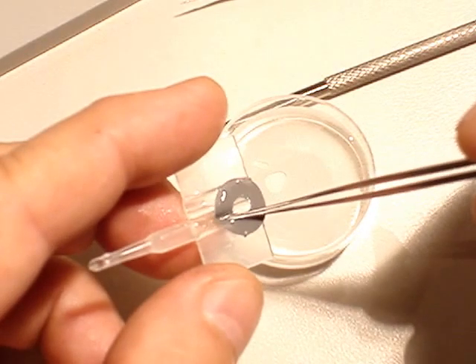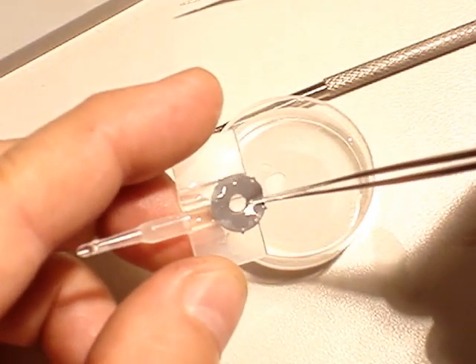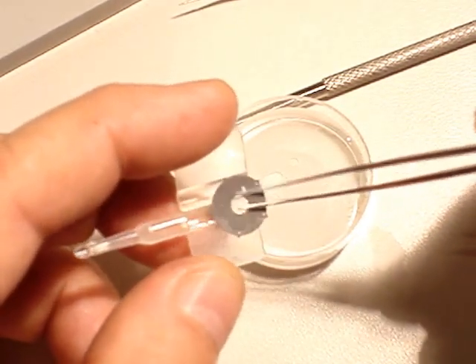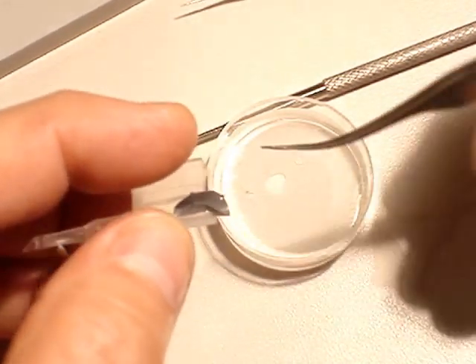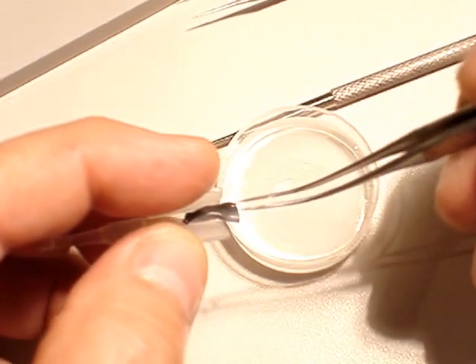Then we take the lens at the halfway point, then we just bend the lens in its own cassette.